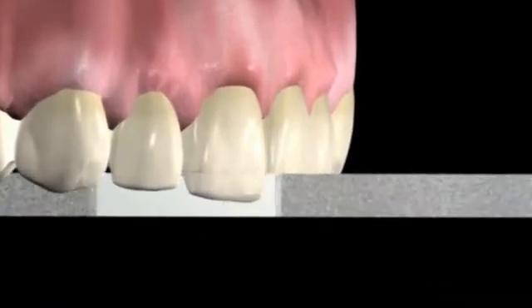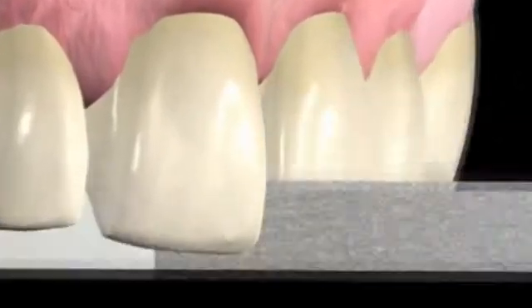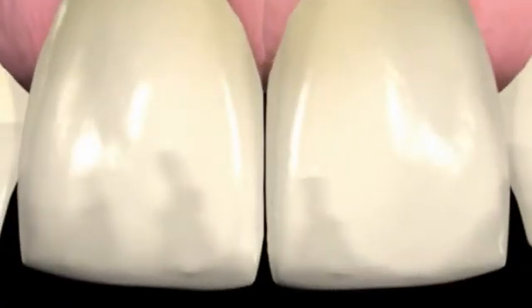Insert the diamond strip using gentle manual separation into the non-cutting area. A fine and medium strip might be necessary.